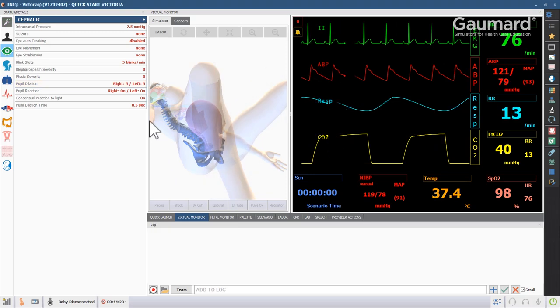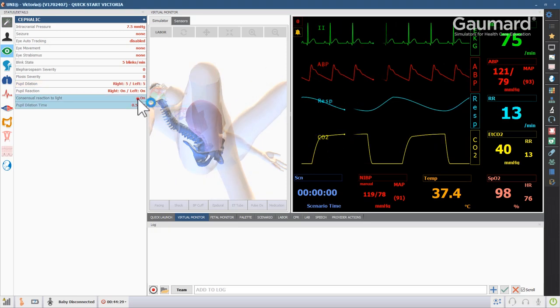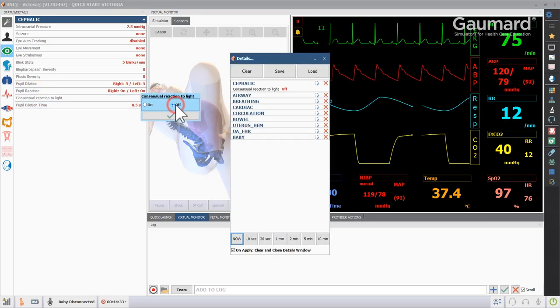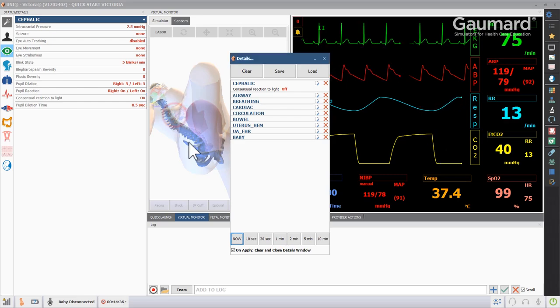Using the consensual reaction to light settings, Victoria can be programmed to have non-consensual pupillary response to simulate the symptoms of trauma and neurological disorders.